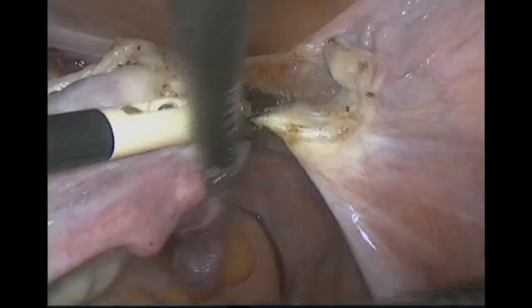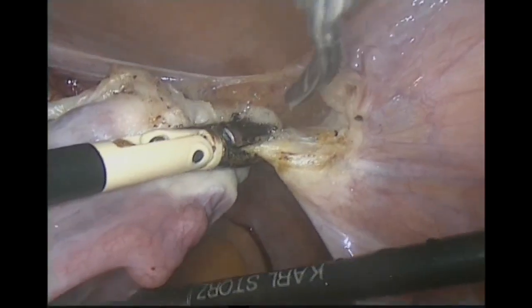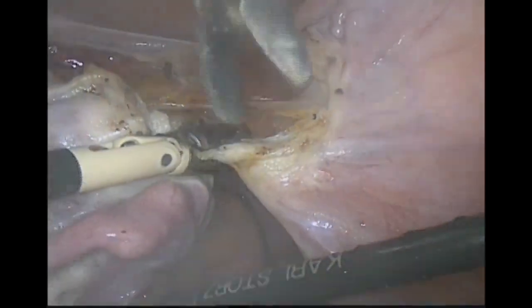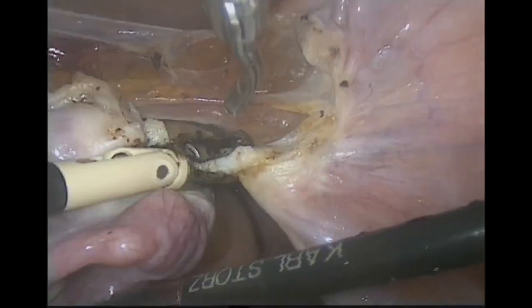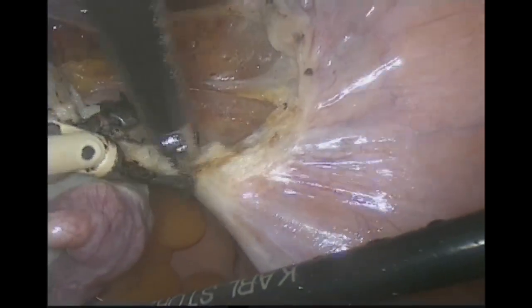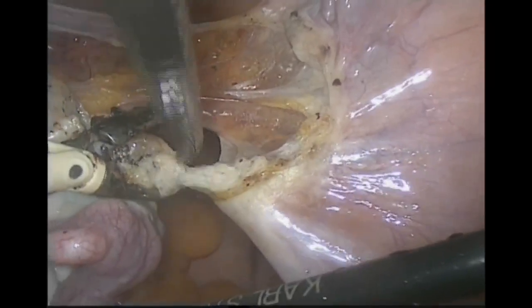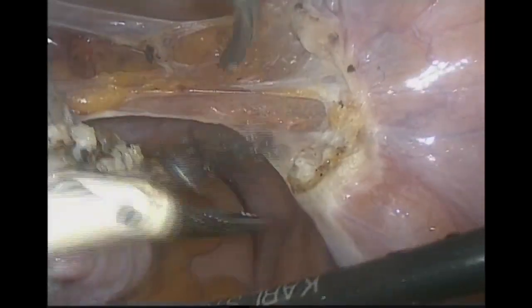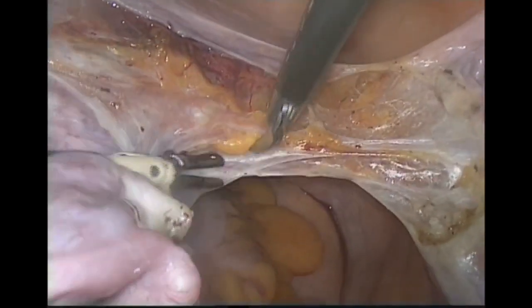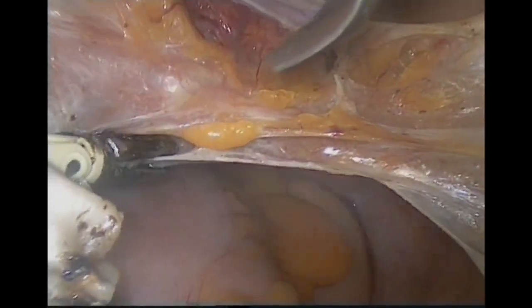So go to the IP ligament toward the ovary, using the cold scissors and simple bipolar, as you see. The rationale here is to take the ovary in a complete way, to avoid any high-grade serous ovarian cancer arising from the fimbria or distal end.